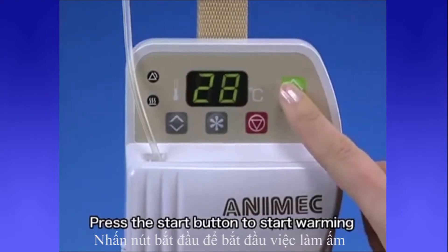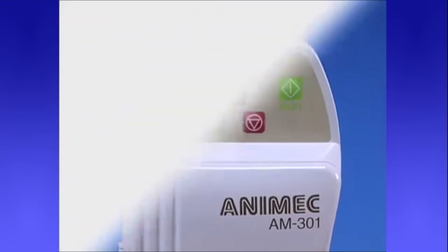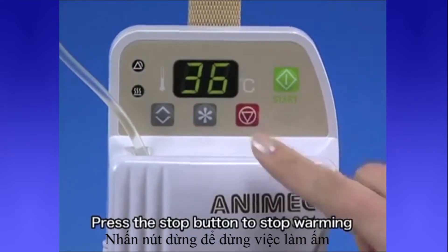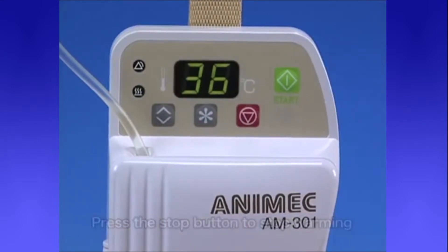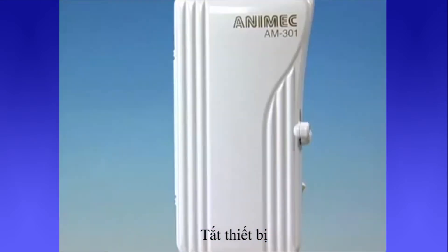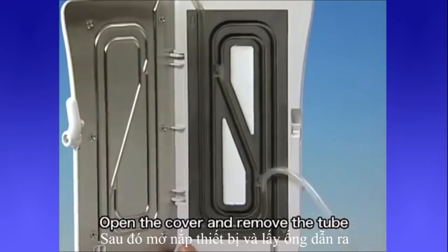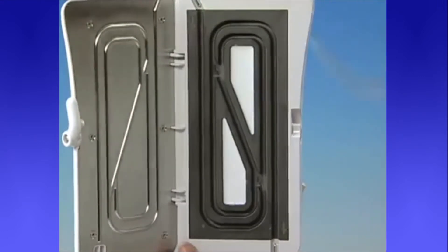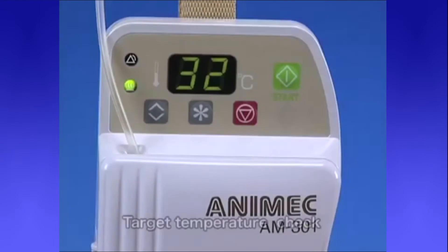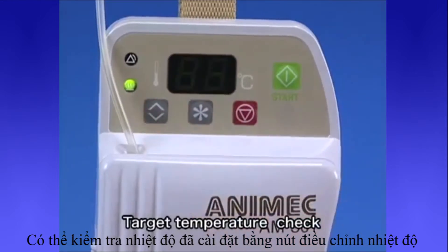Press the start button to start warming. Press the stop button to stop warming. Turn the power off. Open the cover and remove the tube. The temperature setting can be checked with the temperature setting button while in operation.